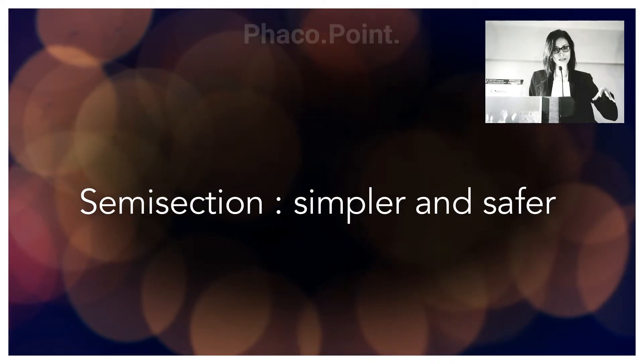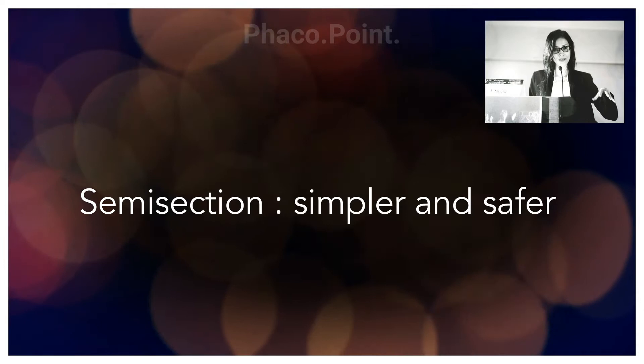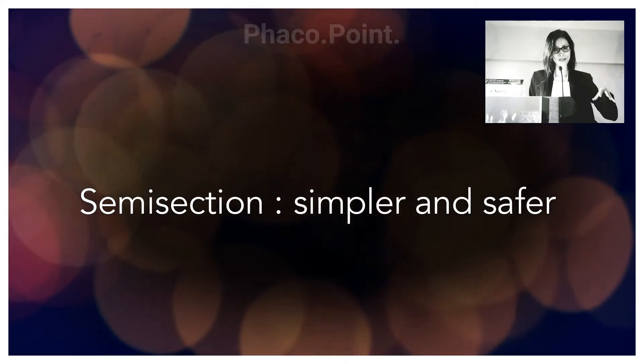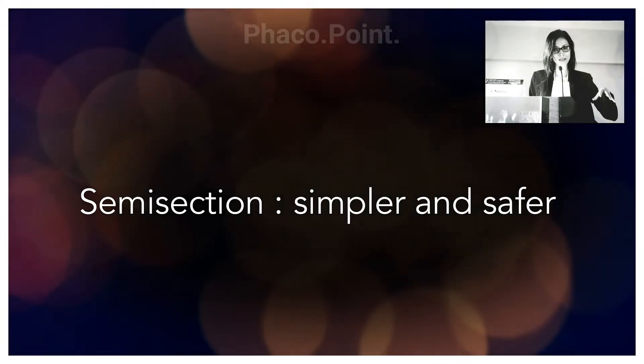Because it remains one complete lens, I feel semi-section is one of the simplest techniques to perform.